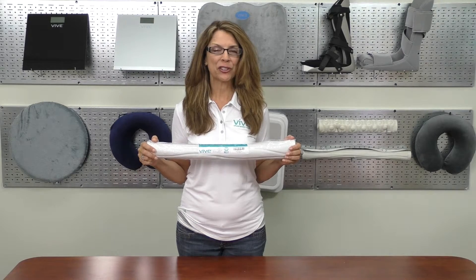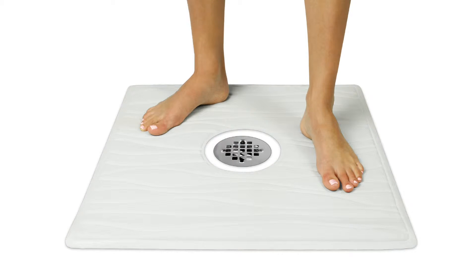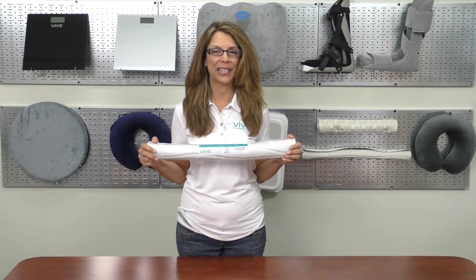The square mat measures 22 inches by 22 inches and has a hole with a 6 inch diameter directly in the center, which allows you to center the pad perfectly around your drain.